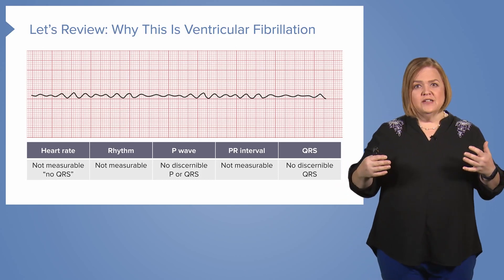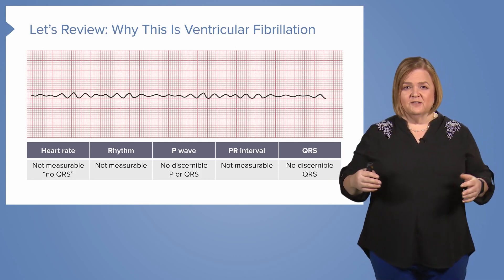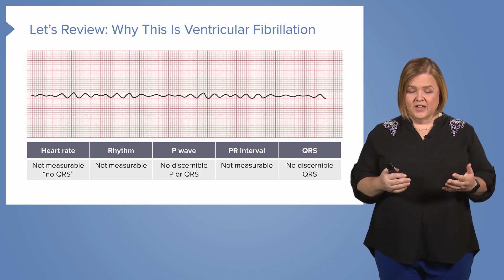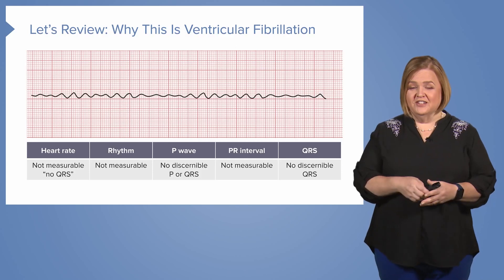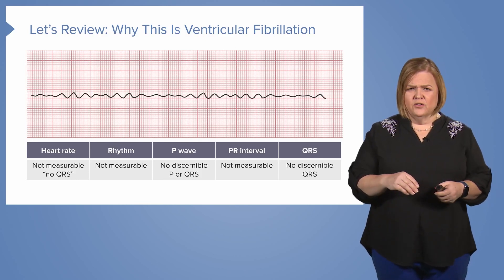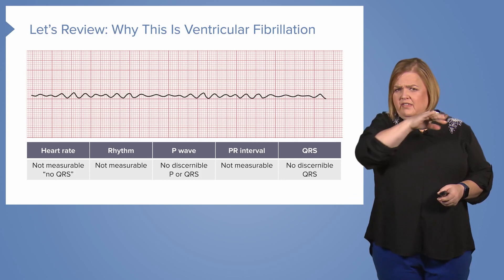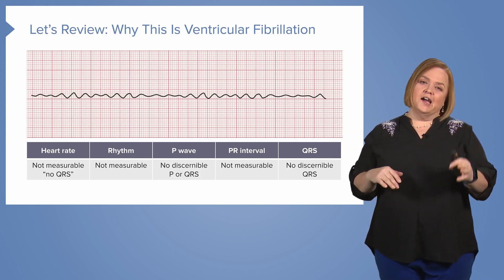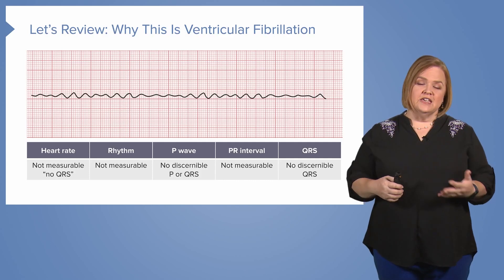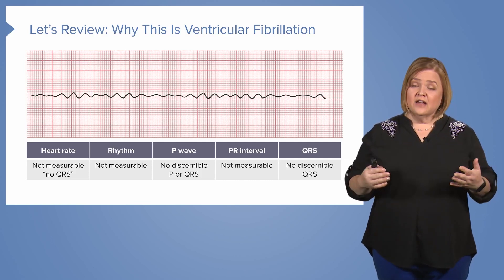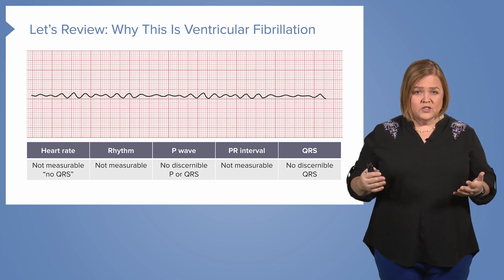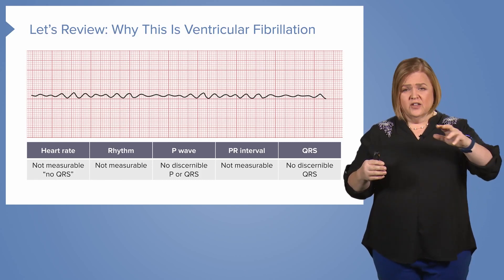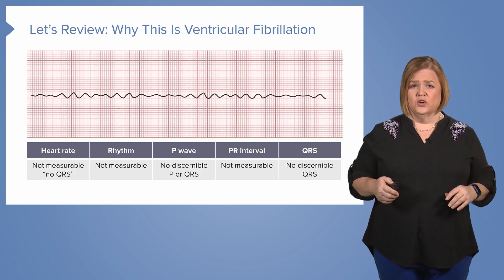So how do you identify ventricular fibrillation? We used to tell unit secretaries who were not trained in how to interpret ECGs: if the monitor goes like this or like this, come get us really fast. This is actually a rhythm that should be easily recognizable. It has none of the parts of the normal sinus rhythm that you have already learned to identify — you're just going to have a squiggly line across the screen.